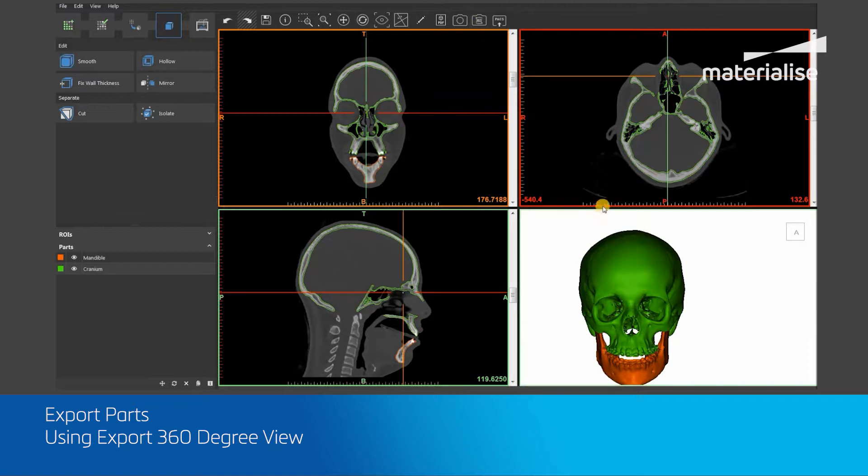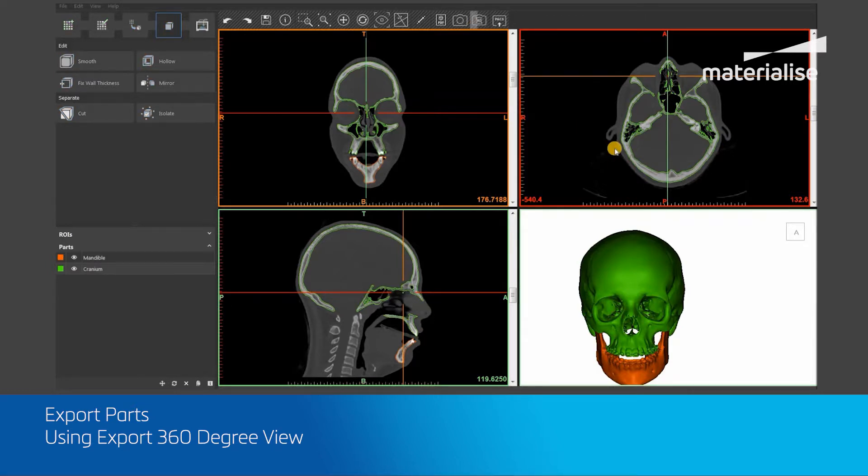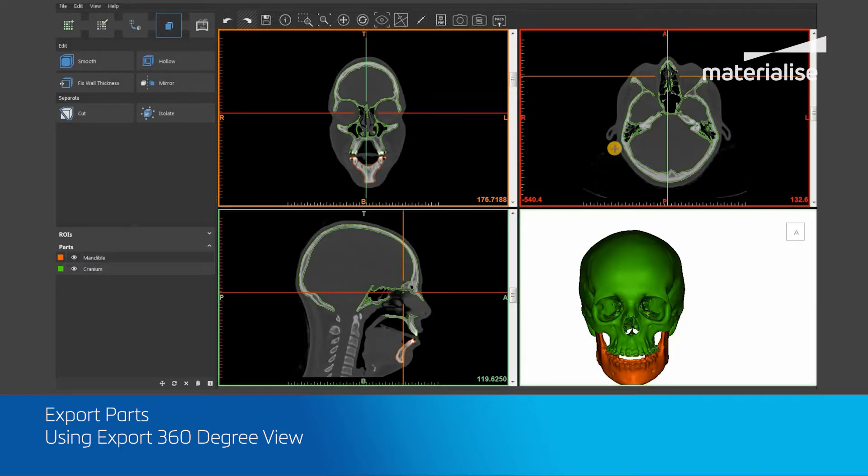The software will then take screenshots of all visible parts at every 15 degrees around a central vertical axis. After that, all these screenshots are exported as one DICOM file to a folder next to the project file.